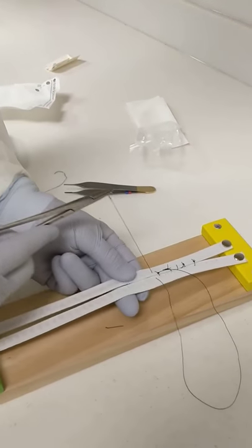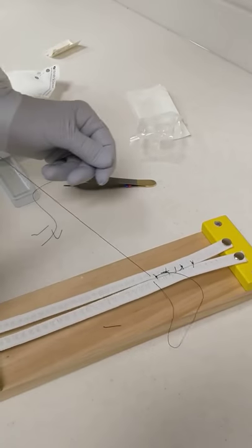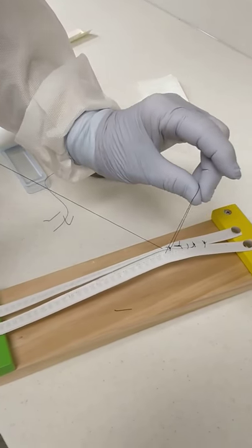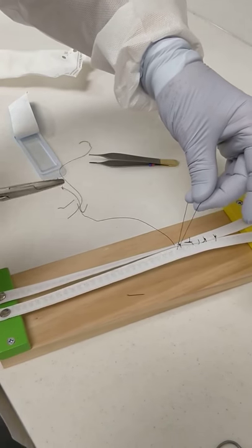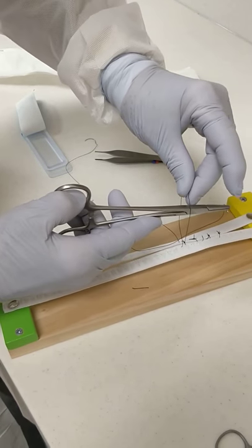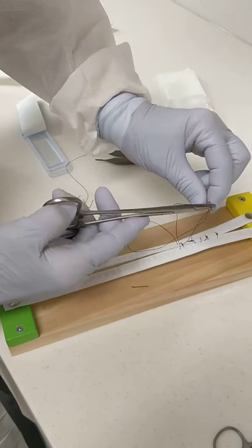The locking suture is like having several interrupted sutures that are all tied together. So, bring this through. Now, you're going to take the loop end and you're going to twist it. And you're going to put the needle back through the back side of that loop, like that.